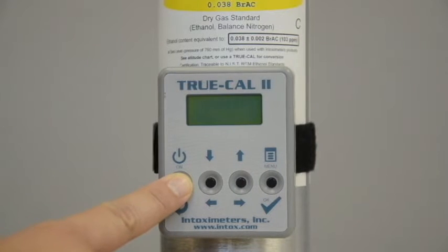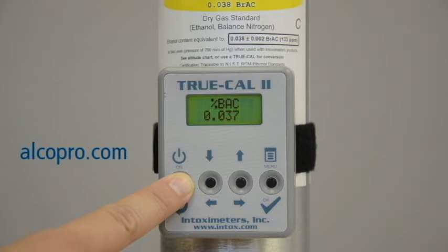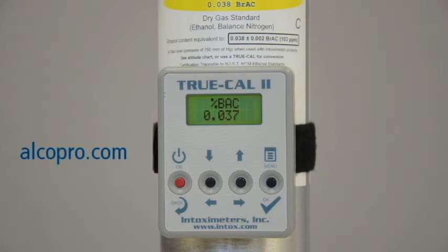You can also derive the expected value of the alcohol gas tank by using a TruCal device, which uses atmospheric pressure to predict the expected value of the gas. You can purchase a TruCal device at alcopro.com.